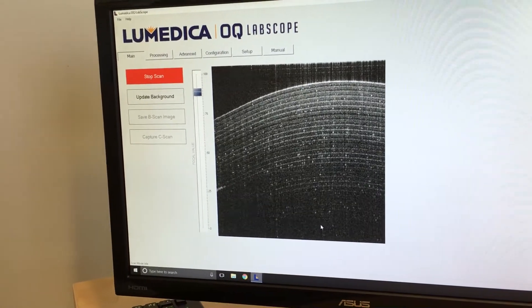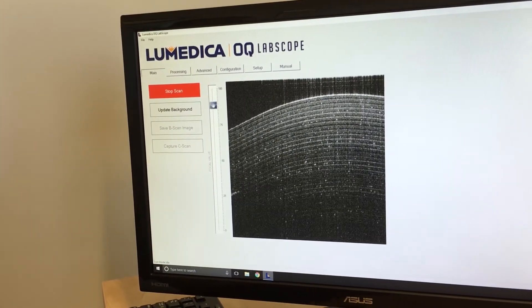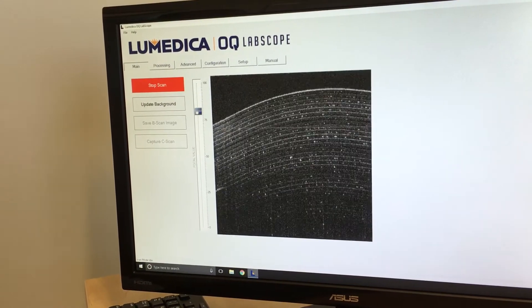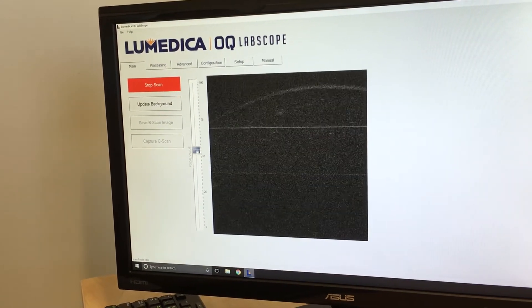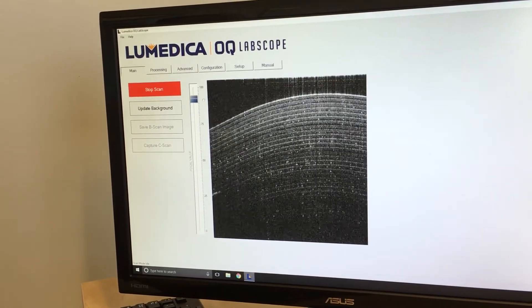A unique feature of the Labscope is its ability to focus electronically, so you can change the focus from the surface deep into the sample.